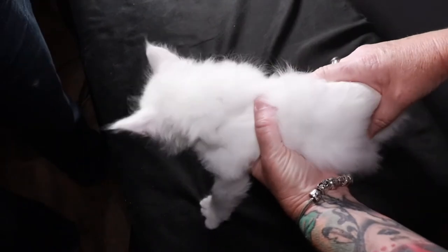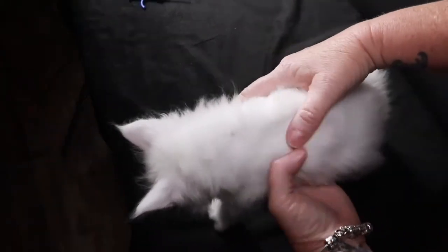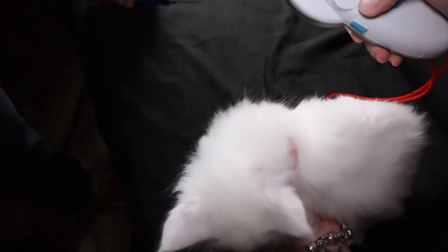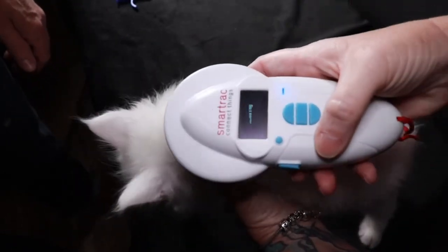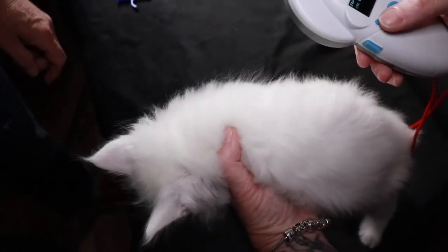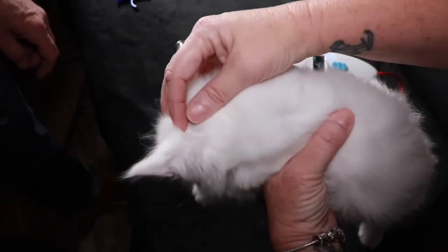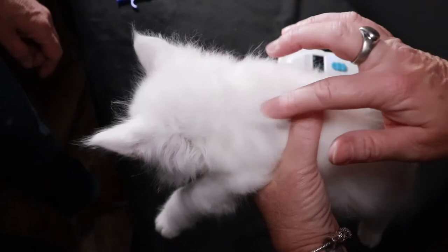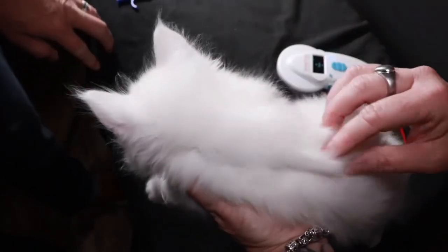He squirmed a little bit. Now I'm going to turn the scanner back on and scan to make sure that it was inserted properly. I'll also move the fur to make sure that it's under the skin, because sometimes you can stick it in and it comes out the other side and then the microchip is just sitting in the hair.